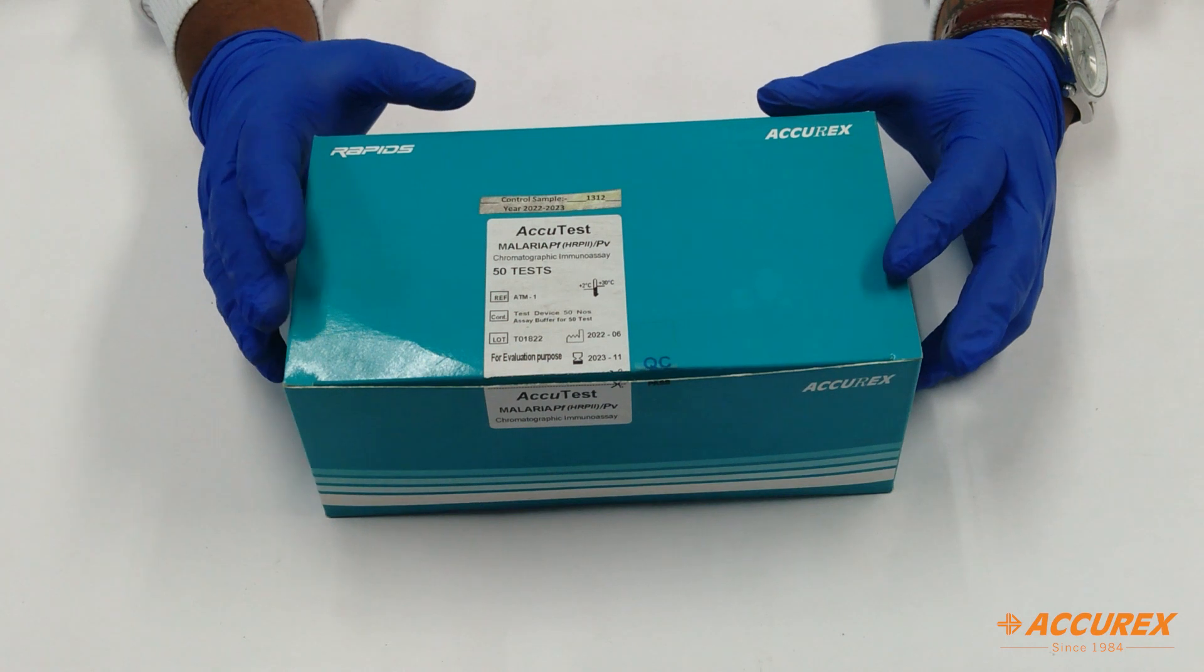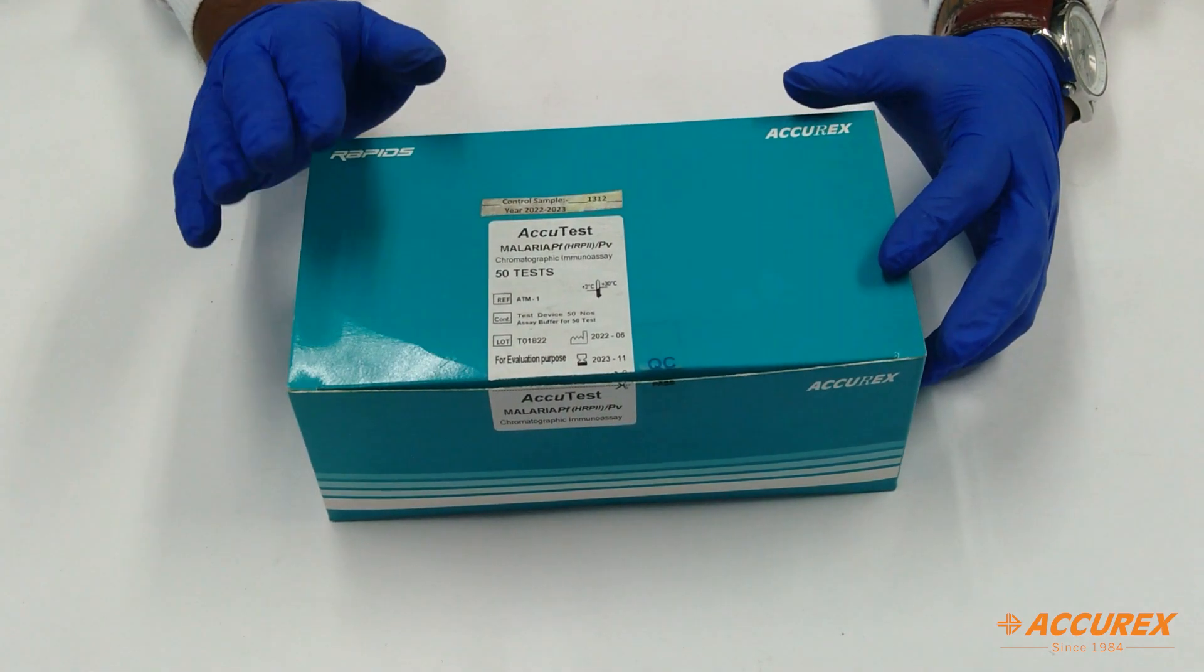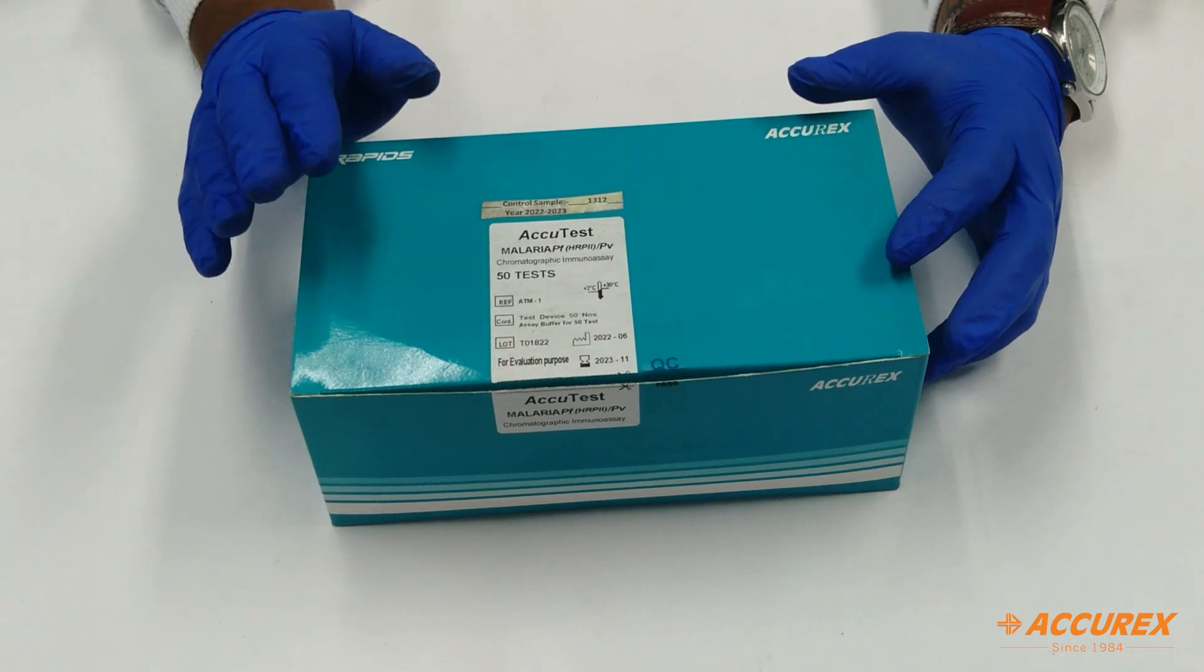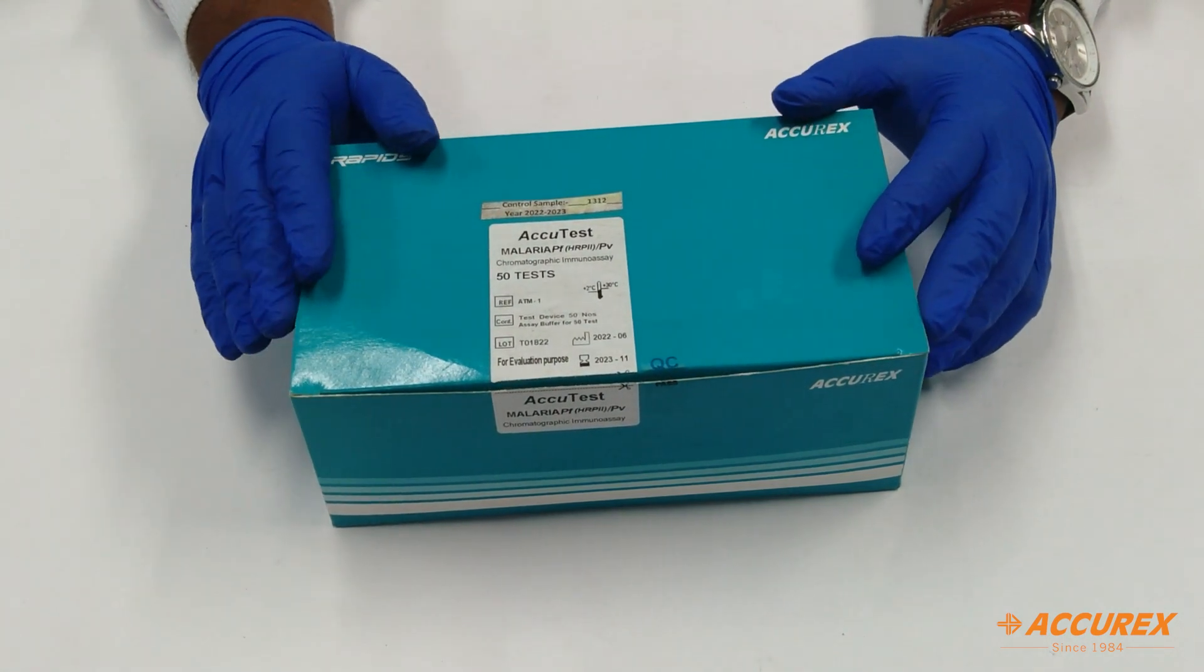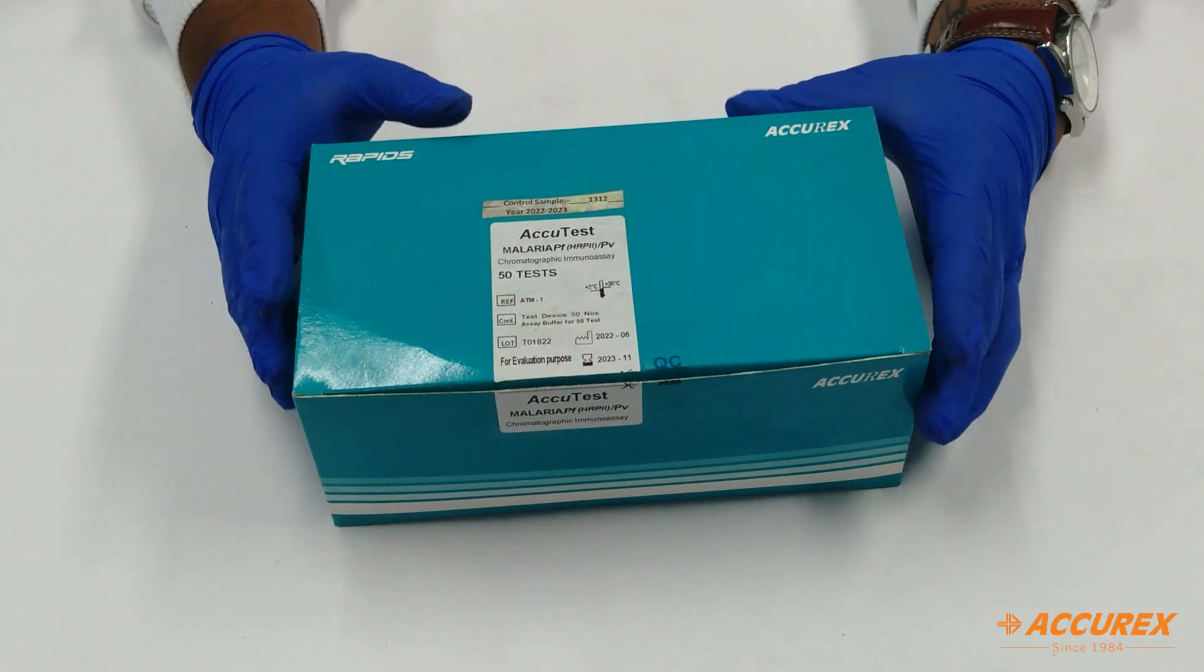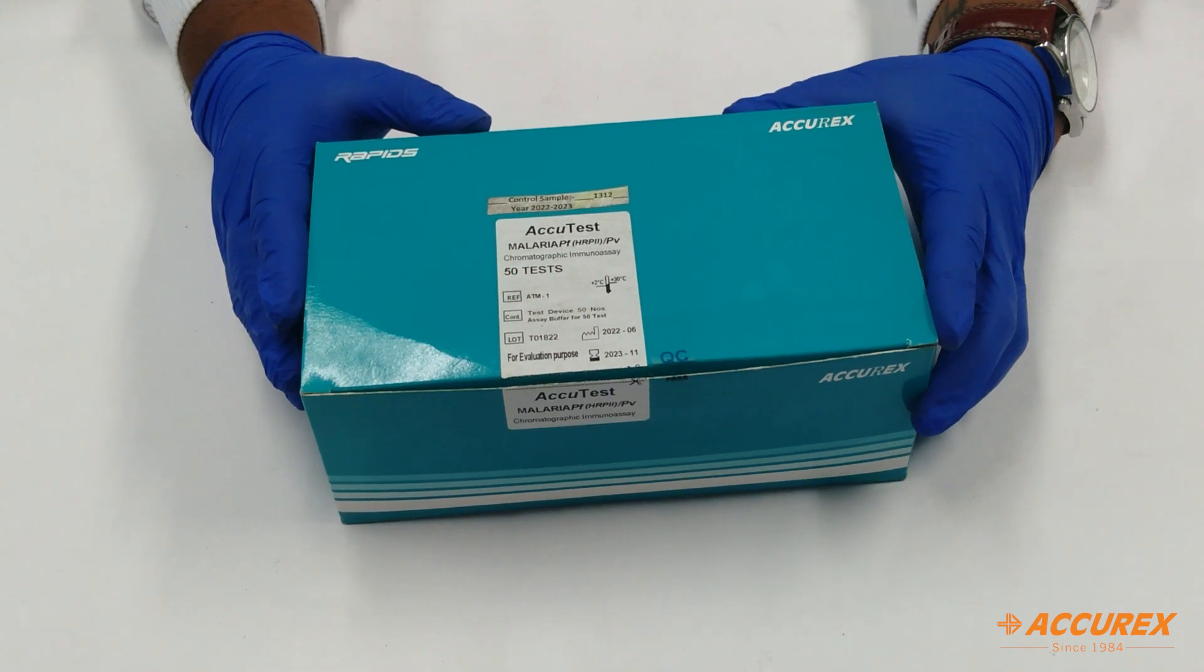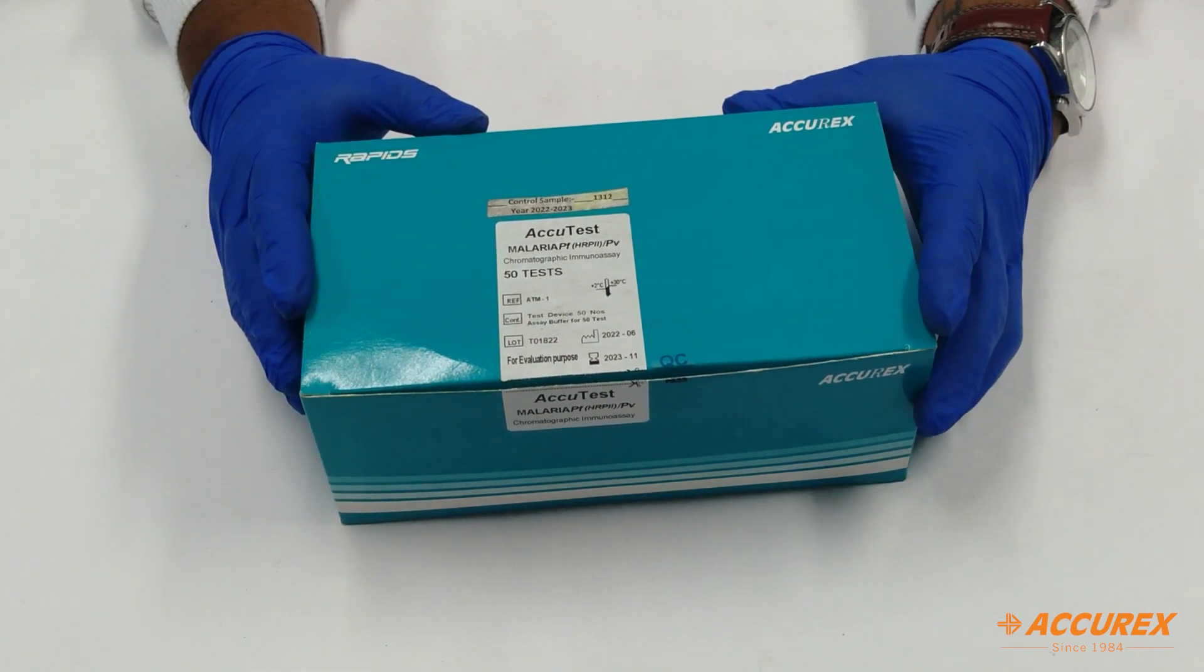So before moving to the component part, first we will see what are the precautions needed to be taken for handling or doing the malaria test. So first of all, we need to take the blood sample. Blood sample needs to be collected in an EDTA tube or directly fingertip sample can be used.